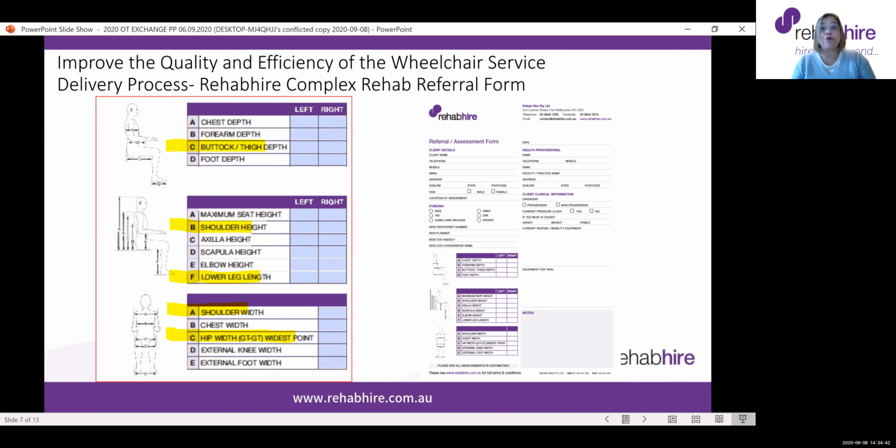We also might want to know what equipment they want for trial. And when I say that, I don't mean a specific make and model. It's important for you as a therapist to identify what are the most key product components that are necessary to meet the client's goals. Is it seat elevate for bed transfers or reaching in the grocery stores, as you saw on the front screen of the presentation? Or is it something that's critical to their function as tilting all day without having to transfer? So please let us know what those things are, and that's only the beginning of the conversation for us, as we will call you and gain additional information as necessary before the appointment.